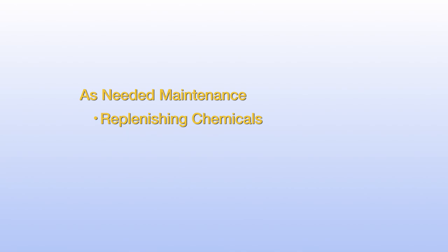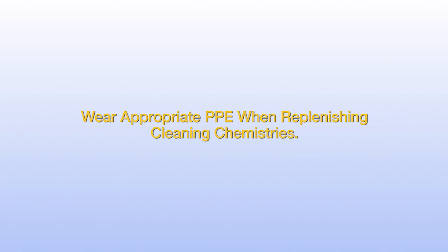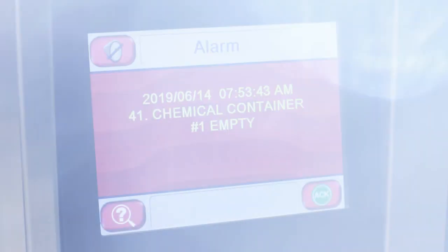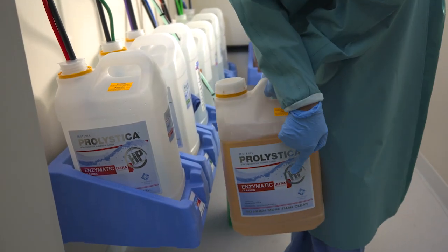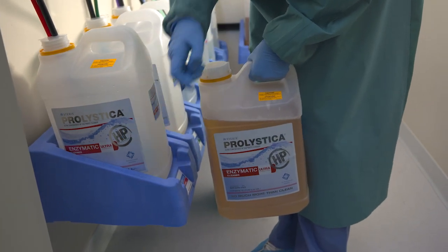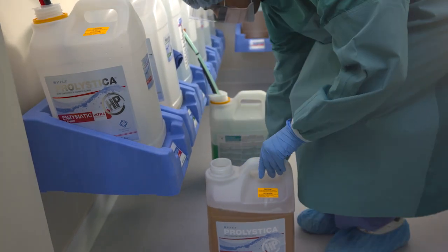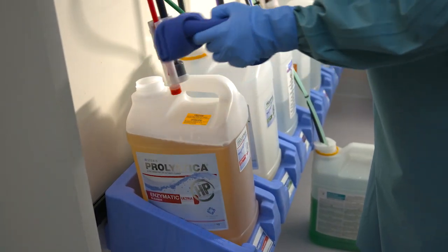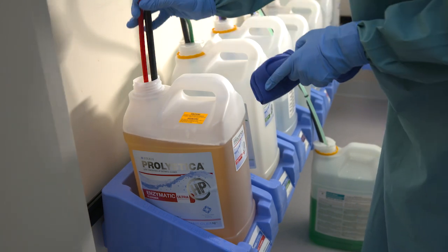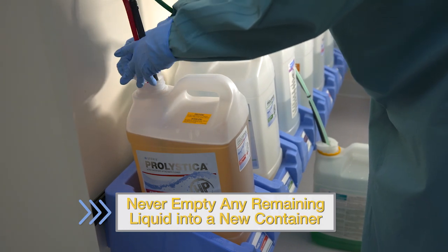Some maintenance activities occur on an as-needed basis. This includes replenishing the processing chemicals and replacing the printer paper and ink cartridge. Wear appropriate PPE when replenishing cleaning chemistries. The low-level sensor will trigger an alarm indicating when levels are too low. Open the new container, placing it near the container you are going to replace. The tubes are color-coded to correspond with their appropriate Prolistica ultraconcentrate containers. Check to make sure you are selecting the correct chemical. Once verified, insert the pickup tube and sensor into the new container, then replace the old container with the new one. For safety reasons, never empty any remaining liquid into the new container.